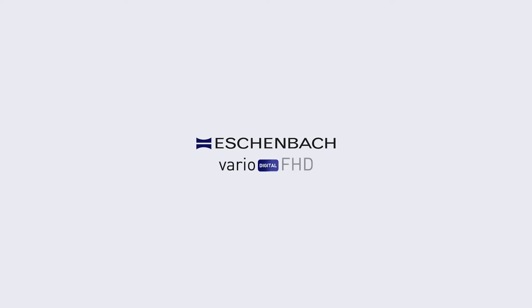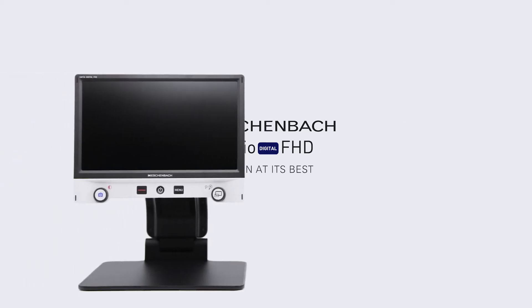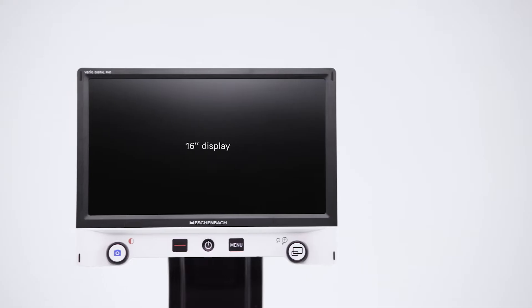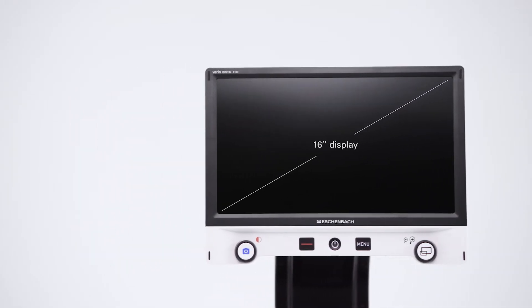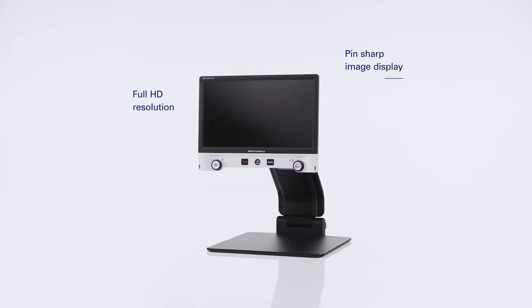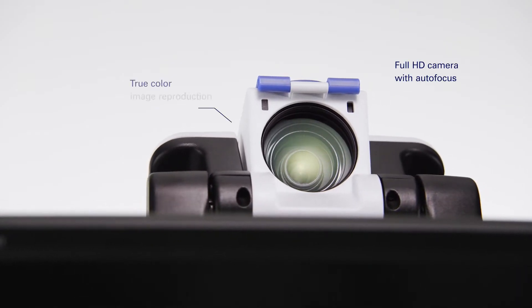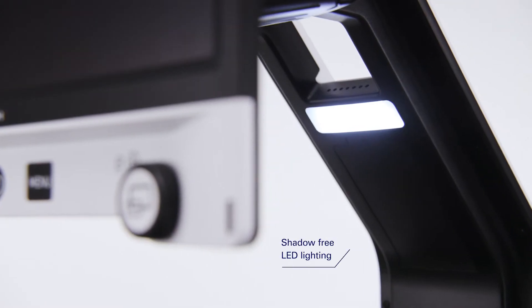The Vario Digital FHD is a portable desktop video magnifier that improves the quality of life of those who have reduced vision. The high-definition non-reflective display with a large field of view guarantees the ultimate in reading comfort with any reading material. The Full HD camera and even illumination ensure a bright and true-color image reproduction at all times.